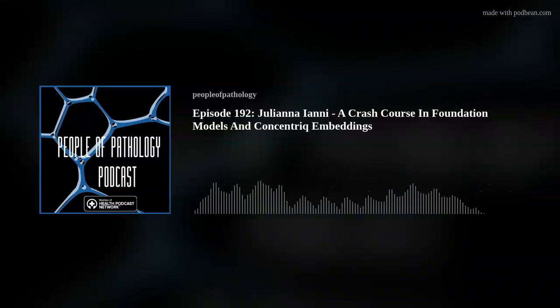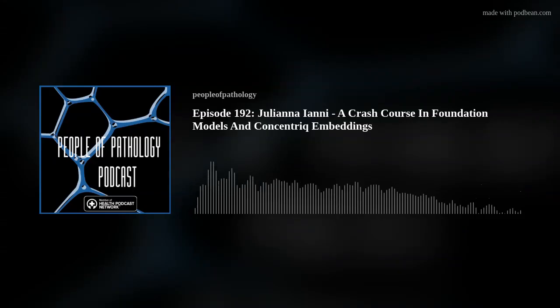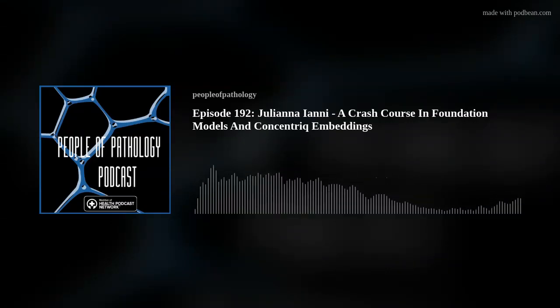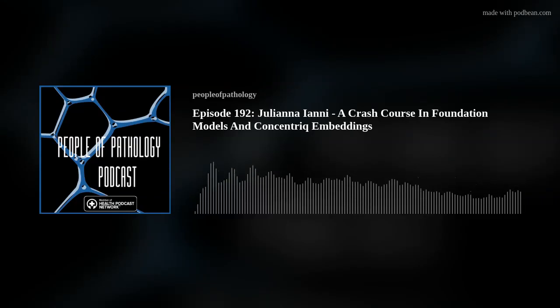Foundation models are definitely a hot topic. They're called this because they provide the foundation from which you can perform a lot of different tasks or solve a lot of different problems. And this is really why they're such a hot topic. So, in short, foundation models are typically just really big models trained with a lot of data.